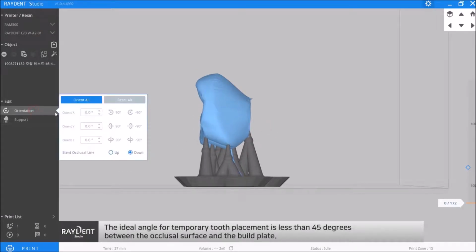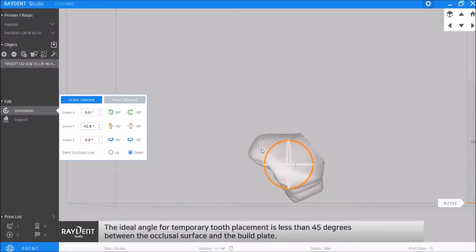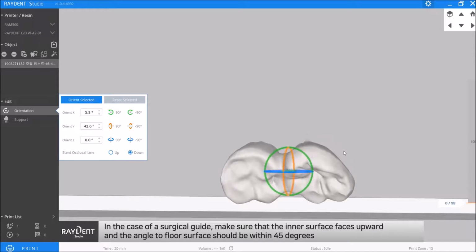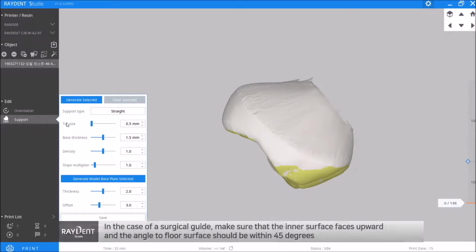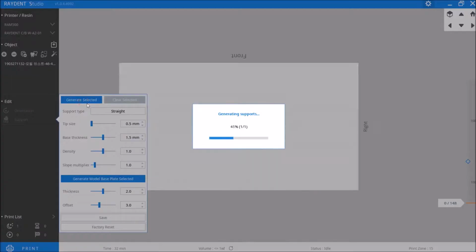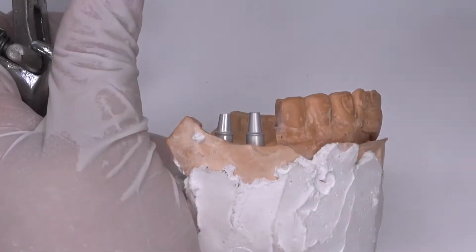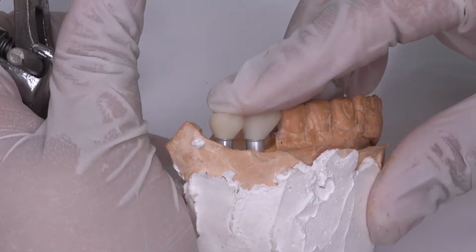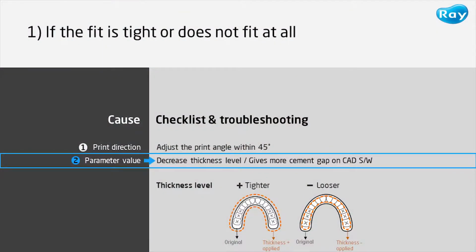For crowns and bridges, the recommended print angle is under 45 degrees between the occlusal and bottom surfaces. So I modified the bridge direction to 45 degrees and added support. After print, the bridge had much better fitness to the model. The angulation rule is the same for surgical guides, but then the inner surface should be facing upward.